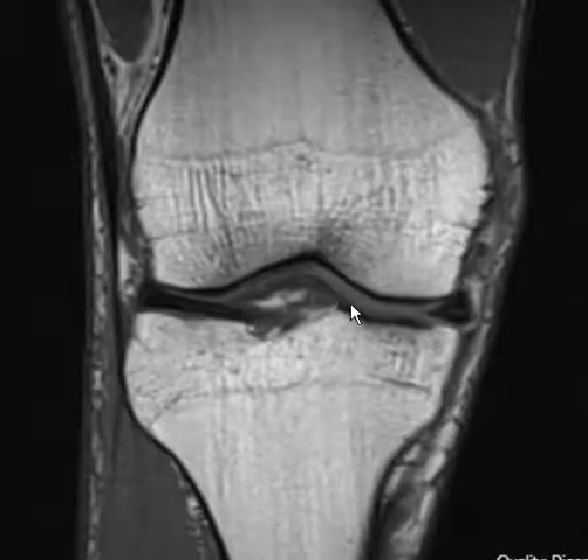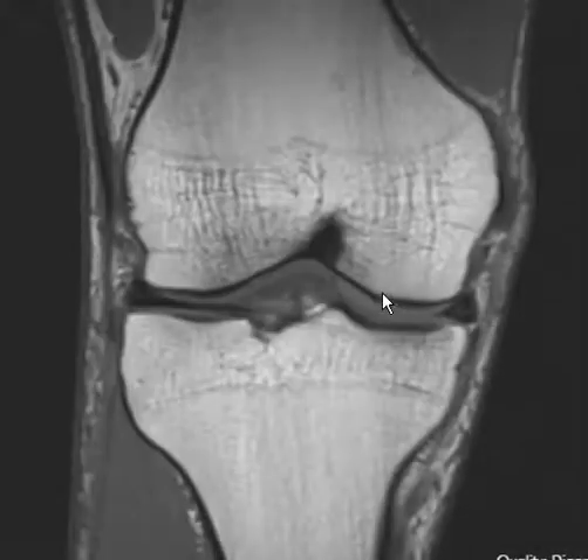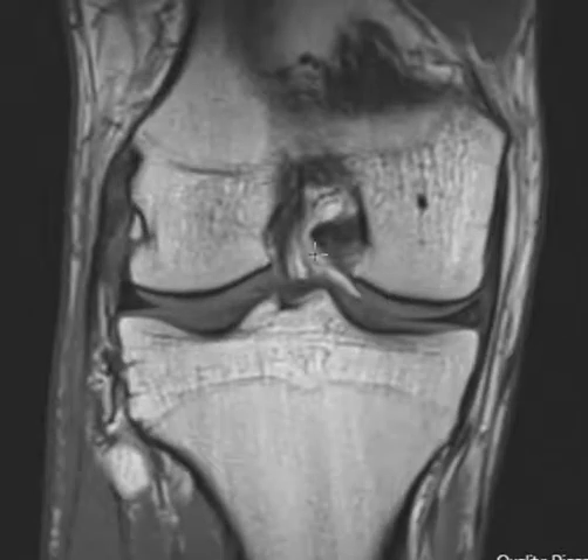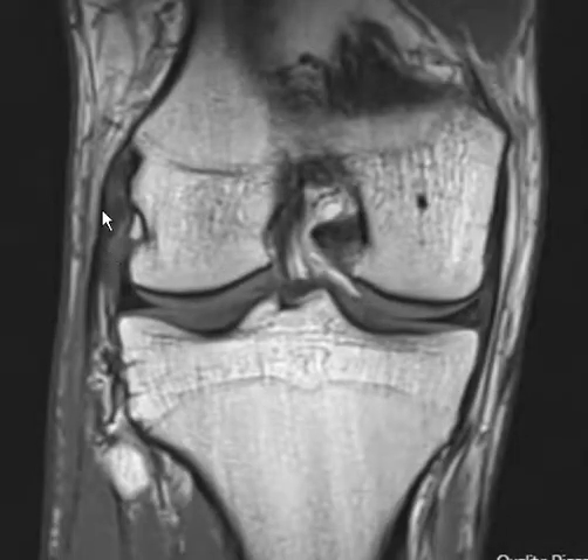Hello, this is Dr. Gay from First Lake MRI. This is a 22-year-old male who had an injury of their knee. They felt a pop in the lateral aspect and subsequent pain. Looking at our lateral collateral ligament complex, we can see that they have a sprain.